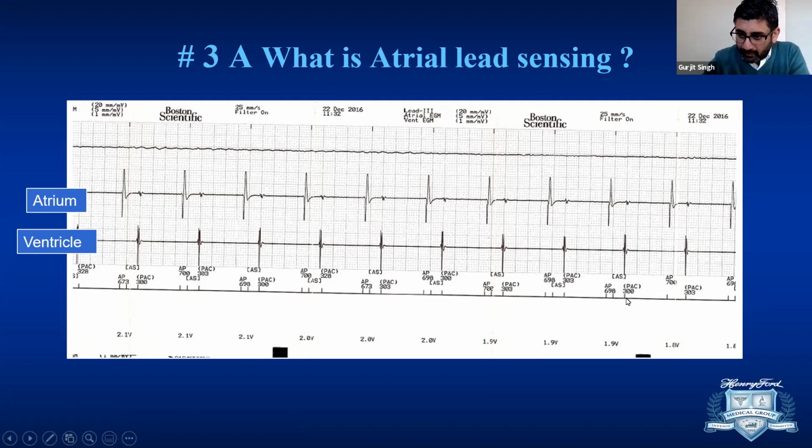Ralph, is anybody responding in the chat, or? We have one saying that there's a ventricular signal sensed by the atrial lead. Someone else says that it's oversensing. And then one is FF, which I'm not honestly sure what that means.